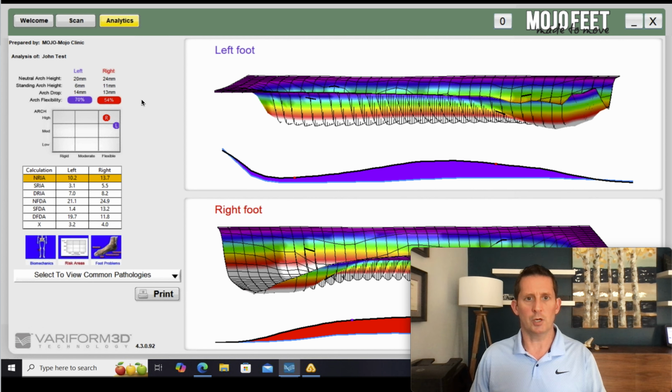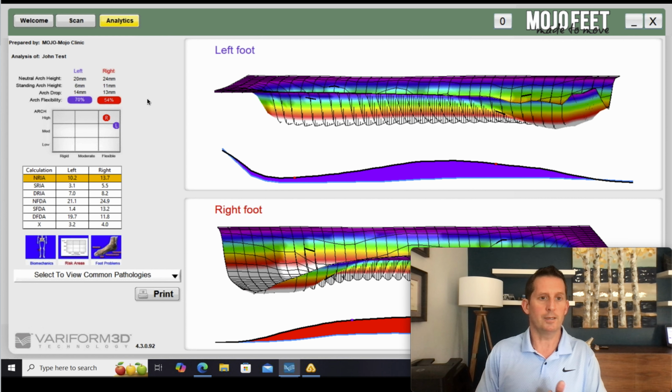Of course, you take these numbers with a grain of salt. Is it always the side of more pronation that has more pain? No. As we all know, we can compensate on the other side for that excess pronation, and that may be where the pain shows up. But in general, that's something we can point out to a patient because they know their asymmetries very well. They may not know why it's happening, or why their right knee hurts more, but they know their asymmetries.